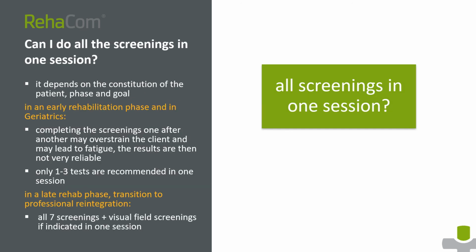You may ask, can I do all the screenings in one session? Please always take into account that each patient has an individual tolerance level. The answer to this question depends on the constitution of the patient, the phase and the goal. In an early rehabilitation phase and in geriatrics, performing the screenings one after another may overstrain the client and may lead to excessive fatigue. The results are then not very reliable.